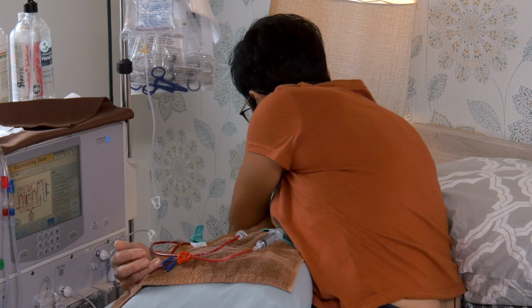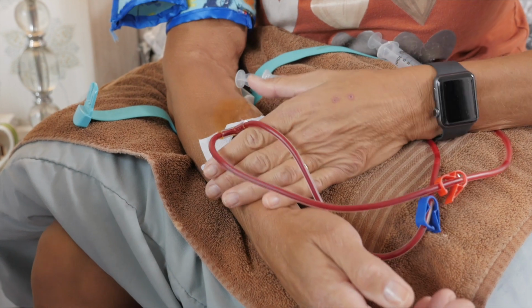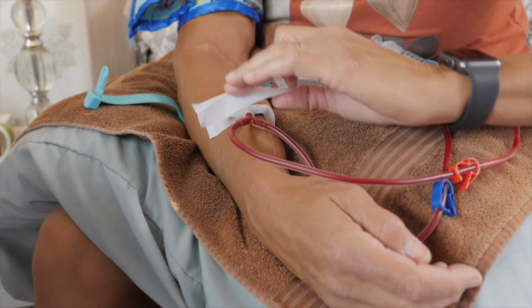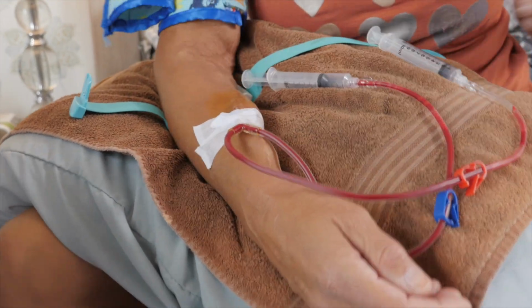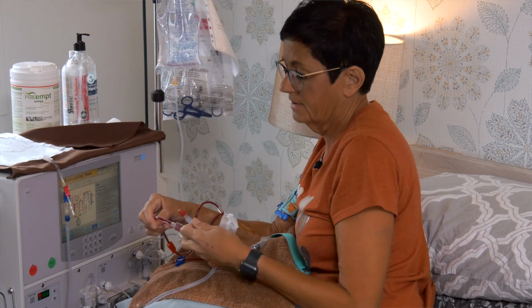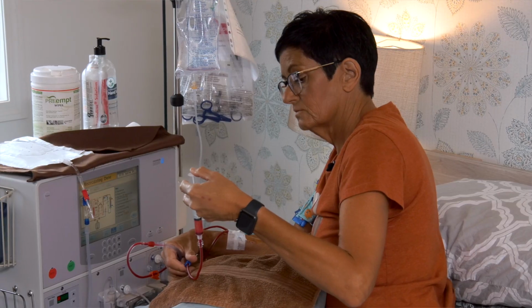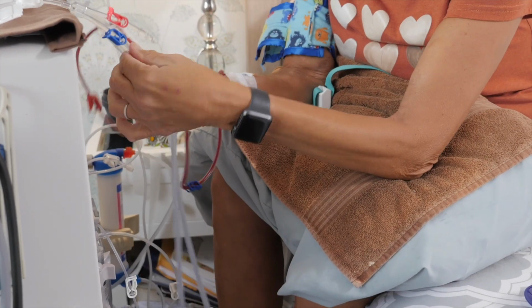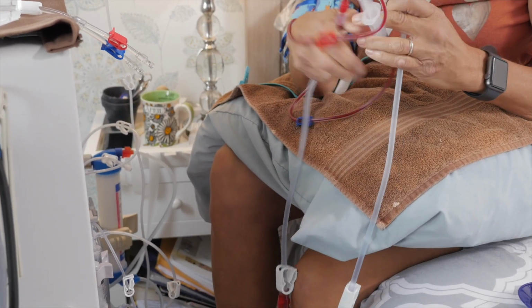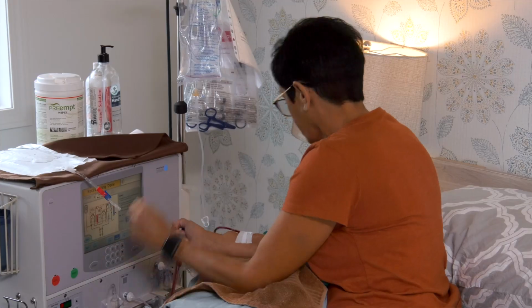Both lines seem to be running well. And anchor it with a little half tape. Give it a good anchor. And then one more tape. You can never have too much tape. And then you take your line off your machine. Red on red. Blue on blue. Give you a 2 ml bolus.